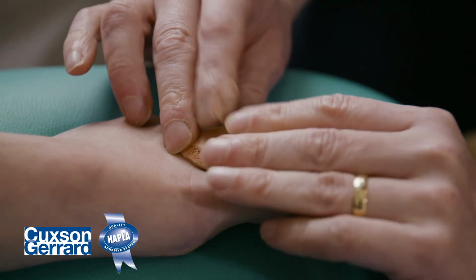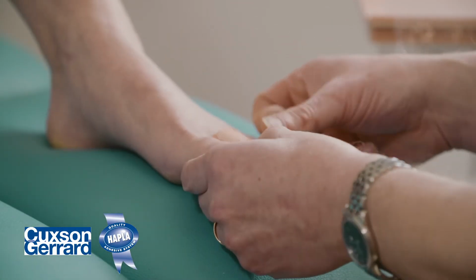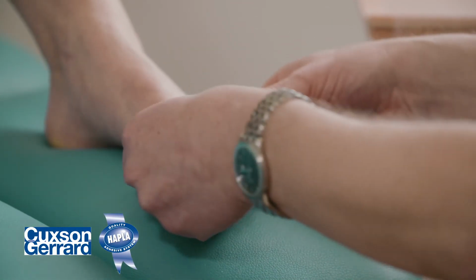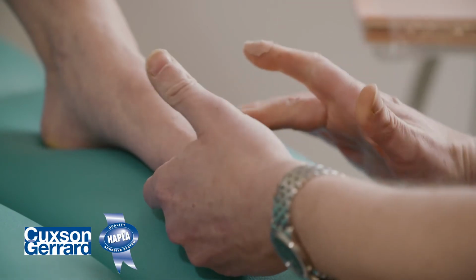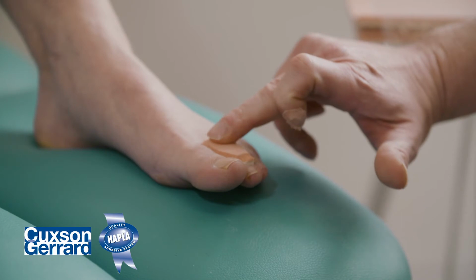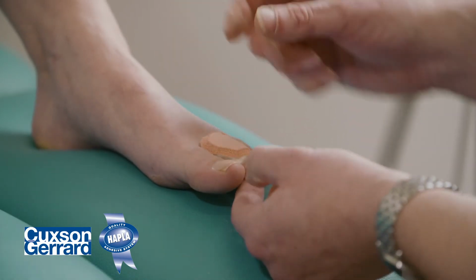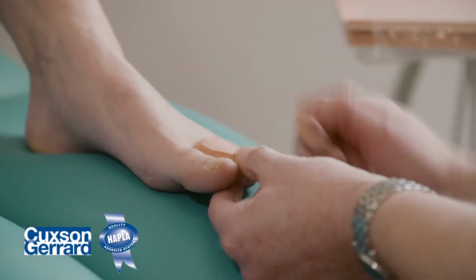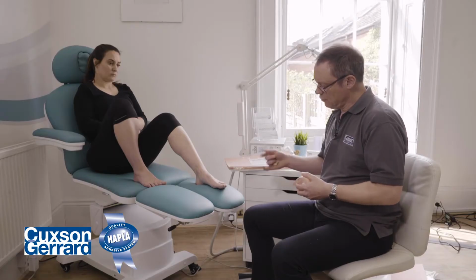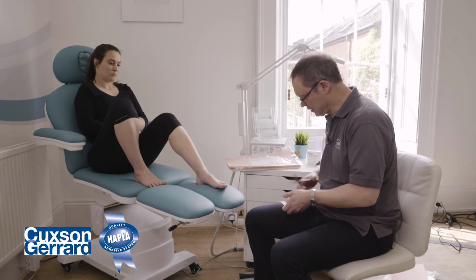Just now curve the shoulders of the pad over the medial and lateral aspects of the toe, and obviously just slightly proximal to the toe too. So we have a continuous surface over the top, and that lesion site is surrounded by a slight aperture to reduce the forces that go on there. Now, in order to secure this pad to the toe, we're just going to use a little bit of Hapla band here.